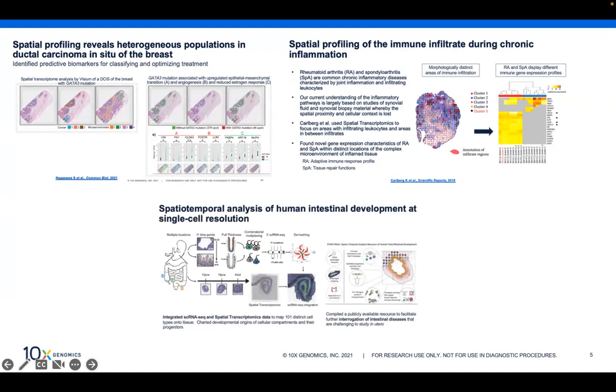of human intestinal tissue. They utilized full thickness sections to really appreciate everything in the wall from mucosa to serosa. And they were able to identify many critical insights into the development. That includes epithelial crypt villus formation, differentiation of mesenchyme, expansion of vascular systems, colonization by immune cells, and also development of the lamina propria and those muscle layers within the bowel wall as well.